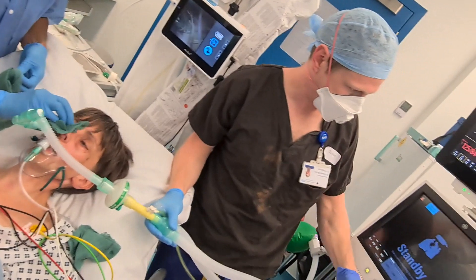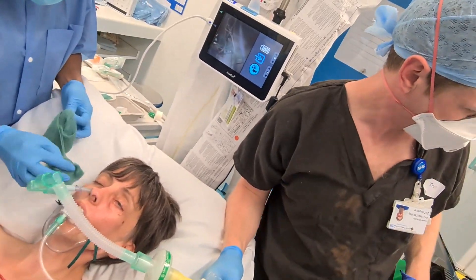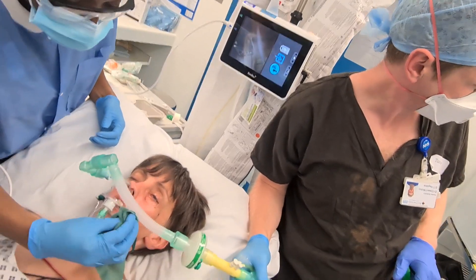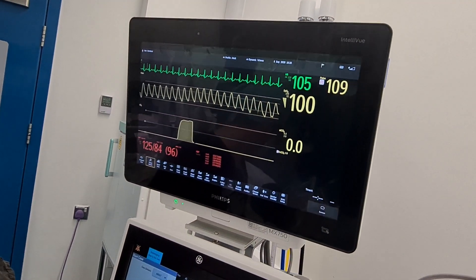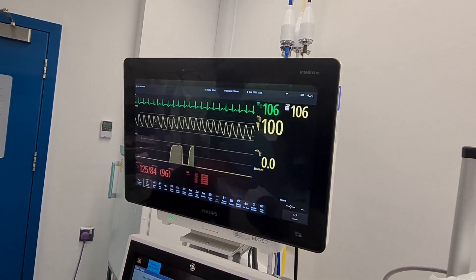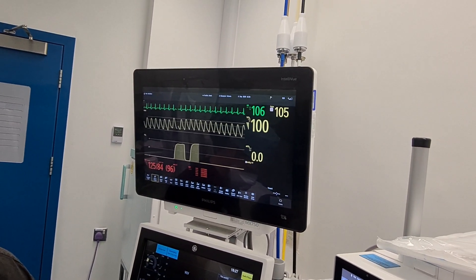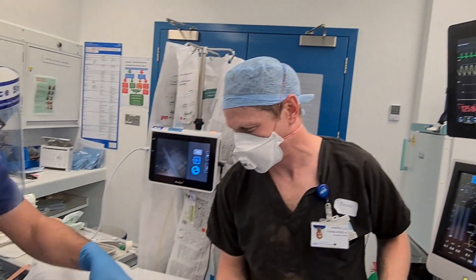Well done. Take some deep breaths for us, Philippa. Right, we've got to switch to the ventilator now. Two coughs — sorry about that. Must be better next time.